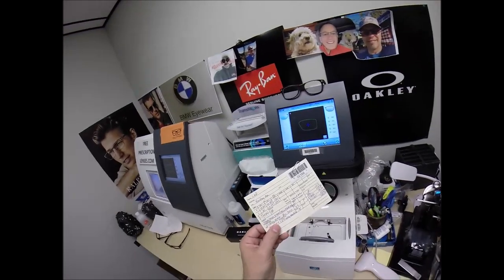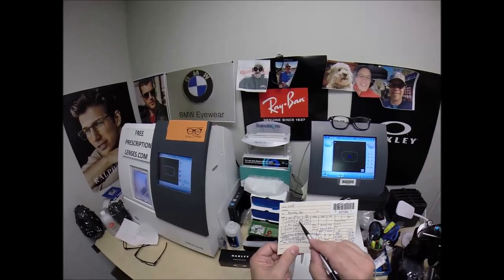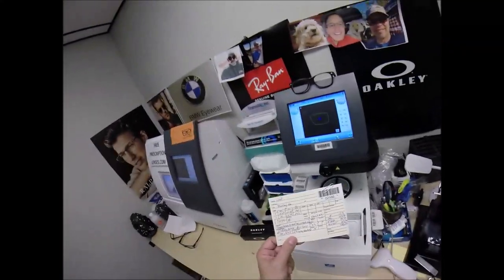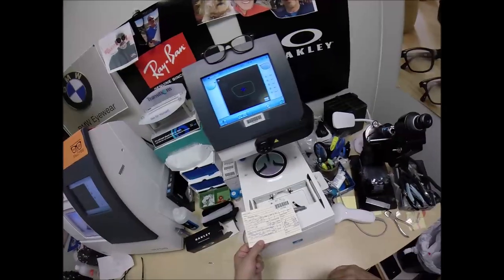Of course, for short periods, you can use over-the-counter reading glasses. But they magnify, but they don't correct for the astigmatism. So if you're doing any long-term reading, this will make things much sharper and crisper.